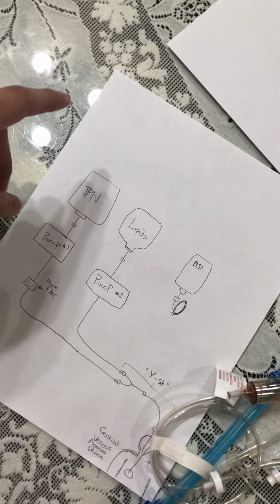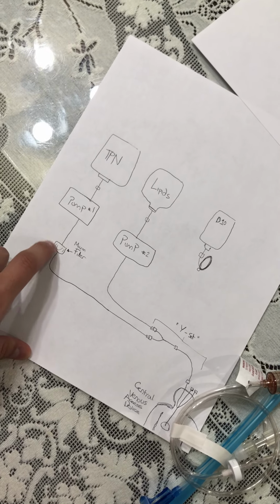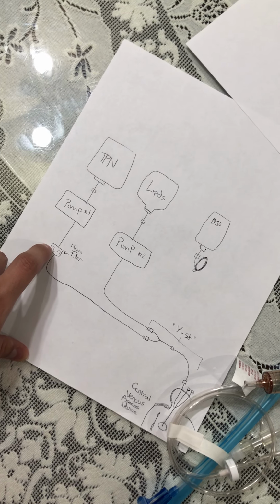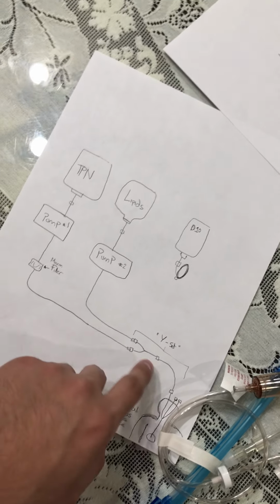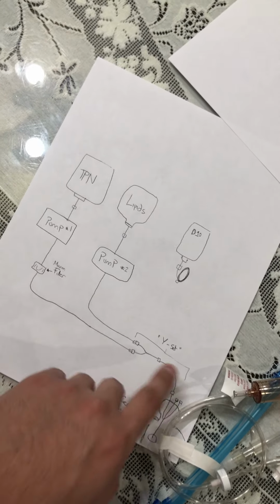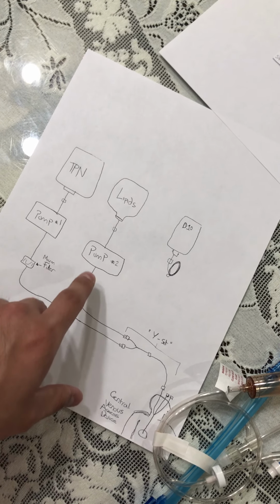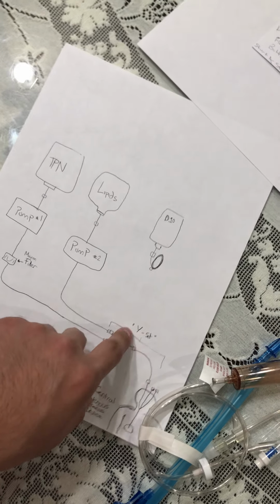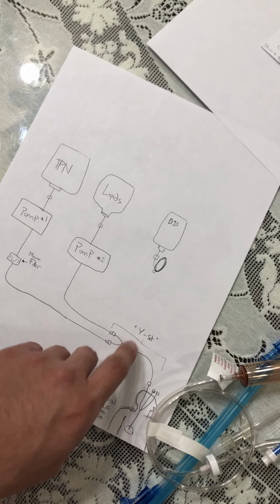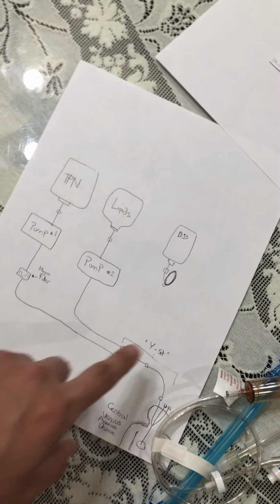Okay, so after that, I want to make sure my TPN solution gets its own pump and my lipid solution gets its own pump as well. I also want to make sure the filter is above the TPN line, because if the lipid line was to encounter the filter, it's going to cause coagulation, and that's not good. So we want the filter separate from the lipid line.